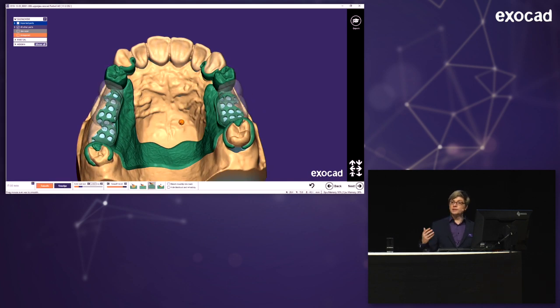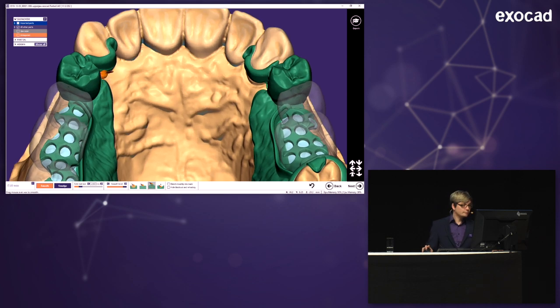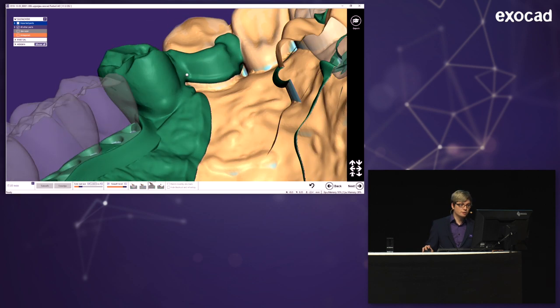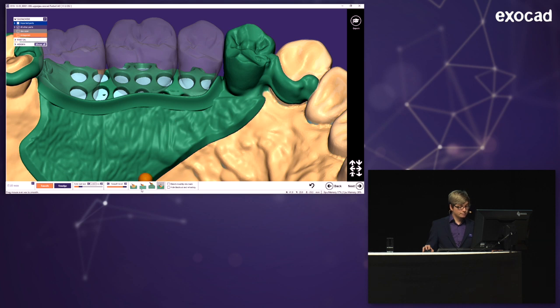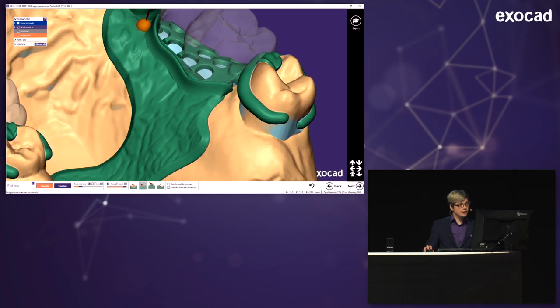And now I have a real freeform option like you're used to. It still works a bit different, but it works also kind of similar. You have here an add, a subtract, also a smooth. And I'm just going to start editing my partial framework on all the parts where I think I didn't really do this good of a job. You can see here I have a really good option to smooth all of this and even start removing the parts where I think that's not needed. The most important thing first is to actually smooth your finish line, because this has to be really nice in the end. So I'm first smoothing both of them, and then I'm going on to everything else.